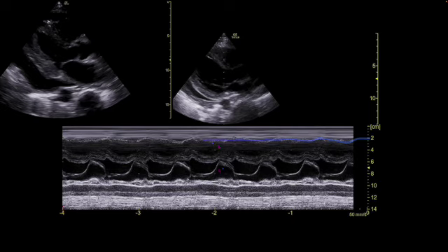So during diastole, mitral valve's open. We come straight up to our RV free wall. Is it bowing in? Is my free wall bowing in during diastole? Yes, it sure is. Send these pictures to CT surgery. They will be right down for this patient. You can call them and say that you see right ventricular diastolic collapse. This patient has early tamponade.